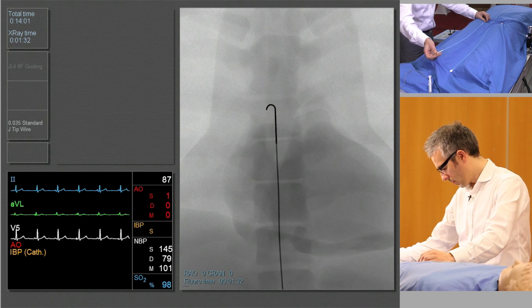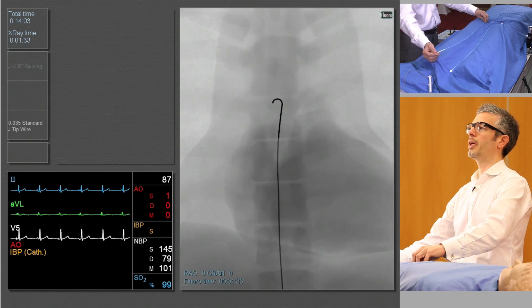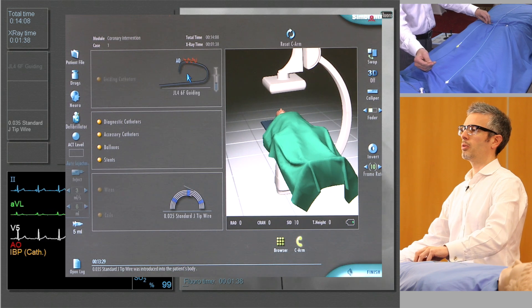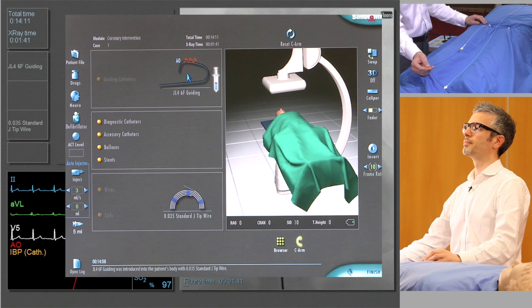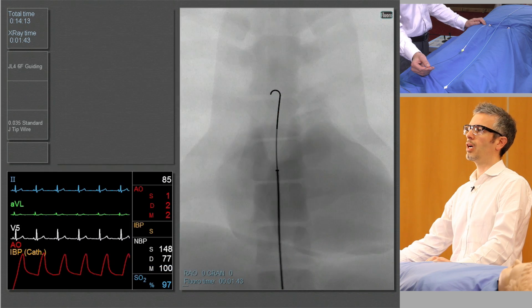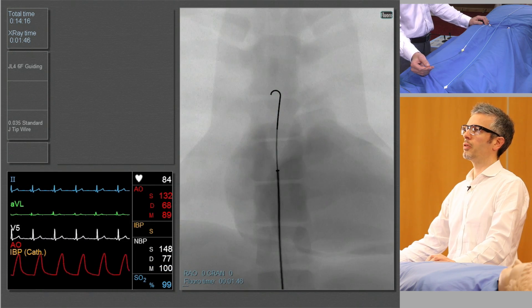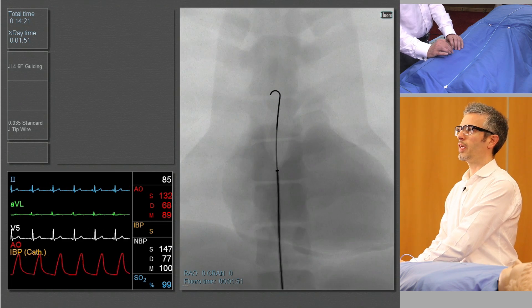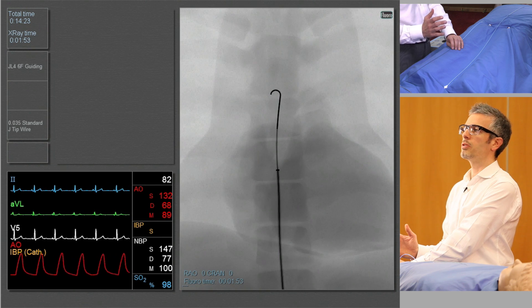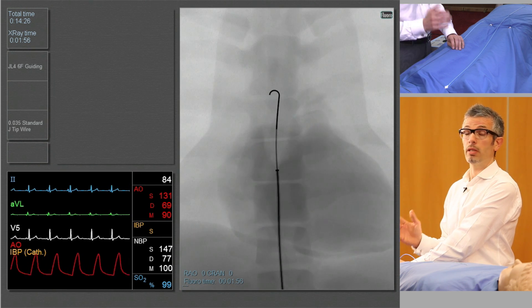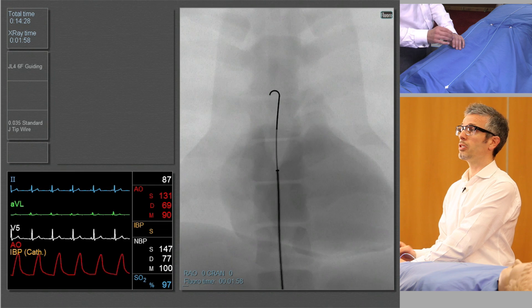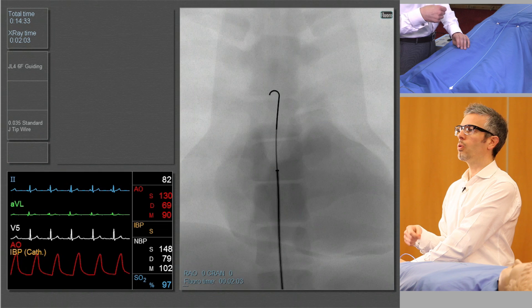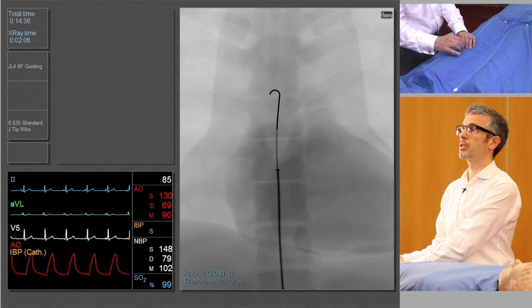We've made sure that we've navigated the coronary tree and not met any resistance on the way. If we were to have encountered that, taking an angiogram would show us a road map of where we need to go. We can see the tip of the guide catheter — this radio-opaque marker just below the tip of the guide wire. I'm now going to advance the guide wire around the arch of aorta. Sometimes when we try to do this, the wire will head up into the left subclavian artery, and we may need to use the wire tip or manipulation of the guide catheter itself to redirect around the aortic arch.